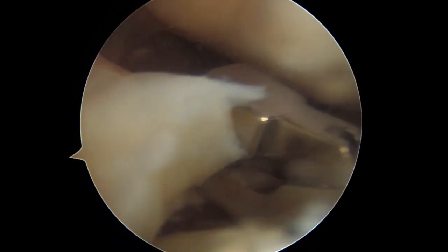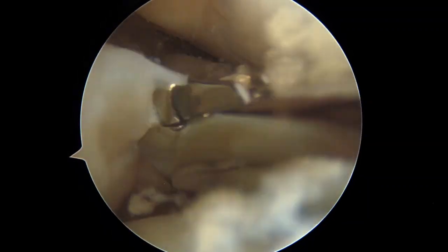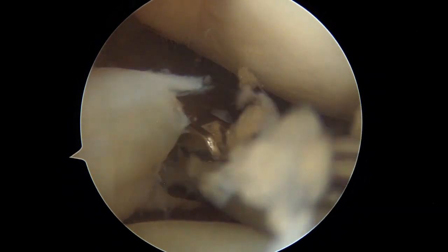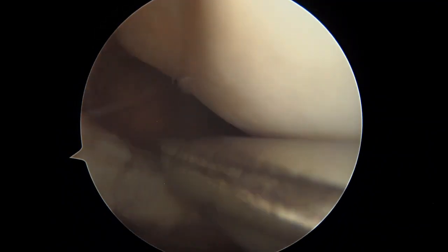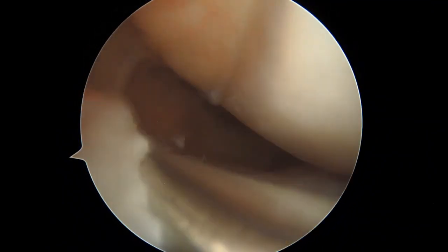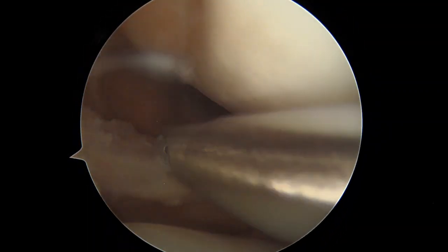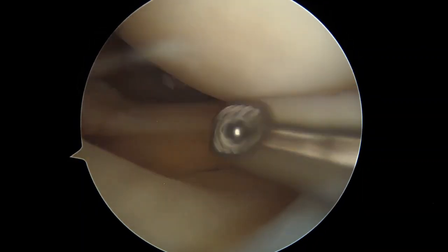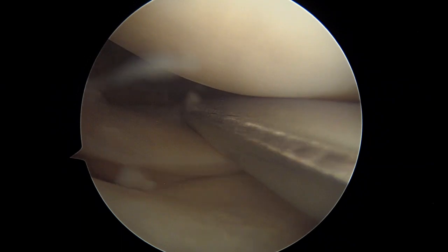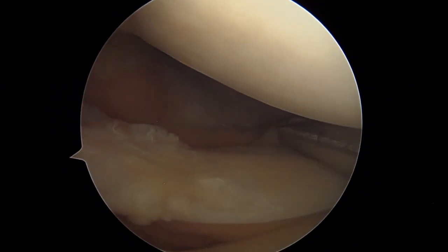We go on with our partial meniscectomy by alternating the action of the basket with the action of the shaver, the motorized tool that not only sections the small fragments remaining after the action of the basket, but also regularizes and makes smoother the residual meniscal surface and allows us to get a smooth, regular and above all stable residual part of our posterior segment of the lateral meniscus.